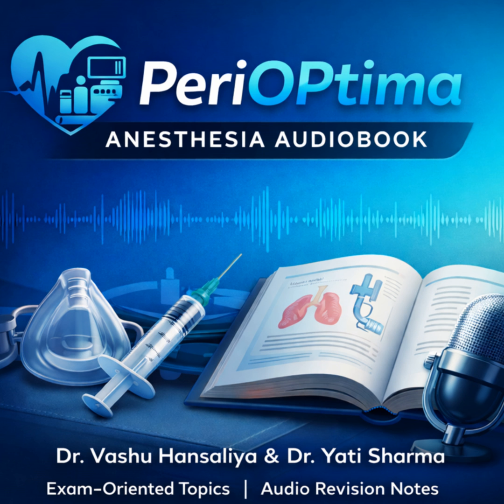First, it allows us to pass a thin orogastric tube for gastric decompression or suctioning. Second, and this is crucial, if regurgitation occurs, the GDC channels those gastric contents away from the airway and out of the patient's mouth. This dramatically improves safety and partially isolates the respiratory and GI tracts. That channeling function is a huge mitigating factor against that aspiration risk. It is. And the second hallmark feature is the improved seal. These devices incorporate advanced cuff geometry or materials that are designed to withstand significantly higher peak inspiratory pressures compared to that 20 centimeter H2O limit of the classic LMA. This enhanced seal is what allows us to use them in more challenging clinical settings.